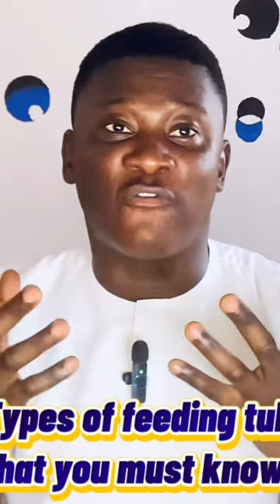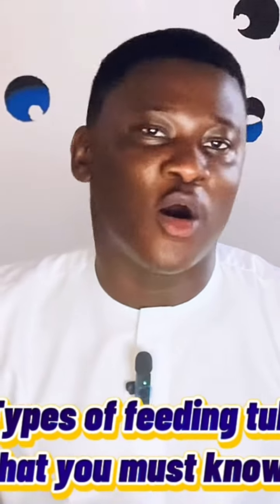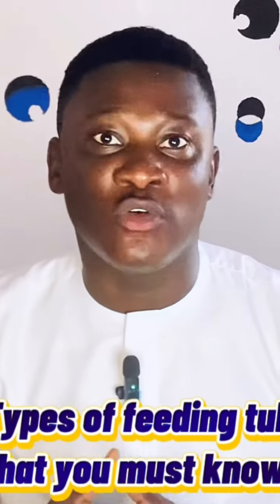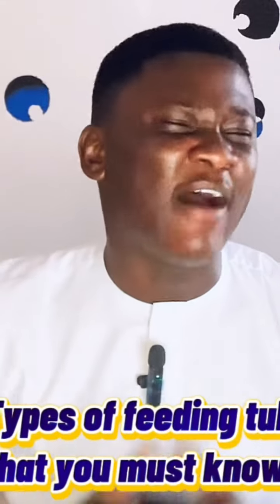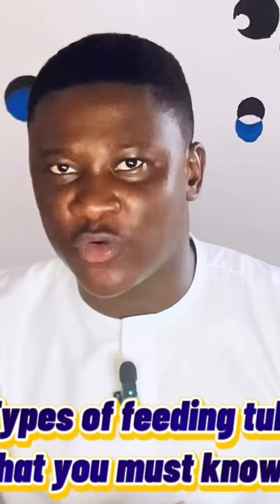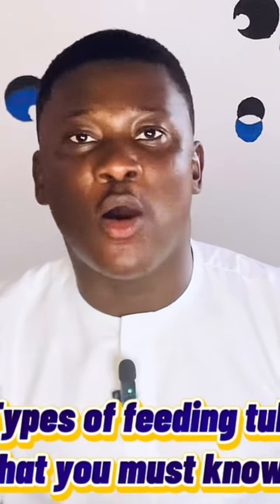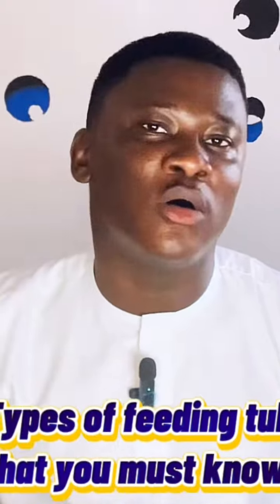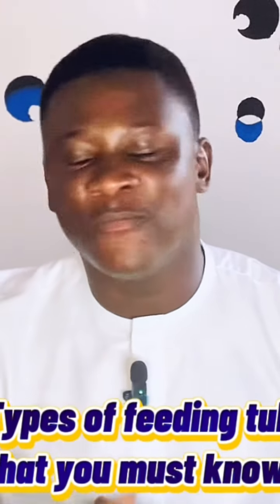That you need to know, or feeding tubes that we use for unconscious patients, helpless patients, or patients who are finding it difficult to swallow. I know, most of you, the common one that most of you know is the NG tube, but no, we have different kinds of tubes that we use for feeding of unconscious patients, helpless patients, or patients who are finding it difficult to swallow. So in this episode, we are going to talk about a whole lot of tubes that we use for feeding.